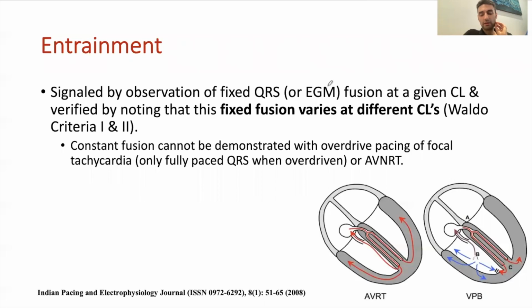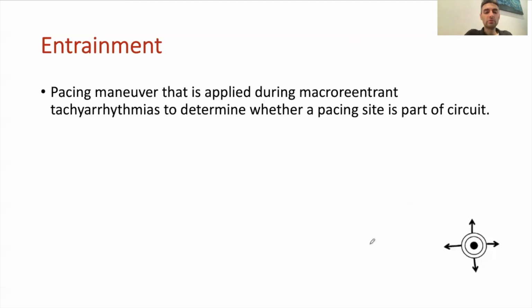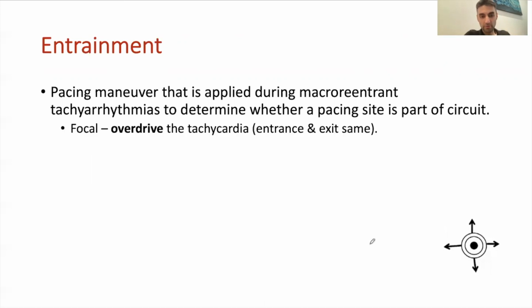So, we already had mentioned this before. With entrainment, simply put, it's a pacing maneuver that is applied during macro-reentry tachycardia to determine whether a pacing site is part of the circuit.